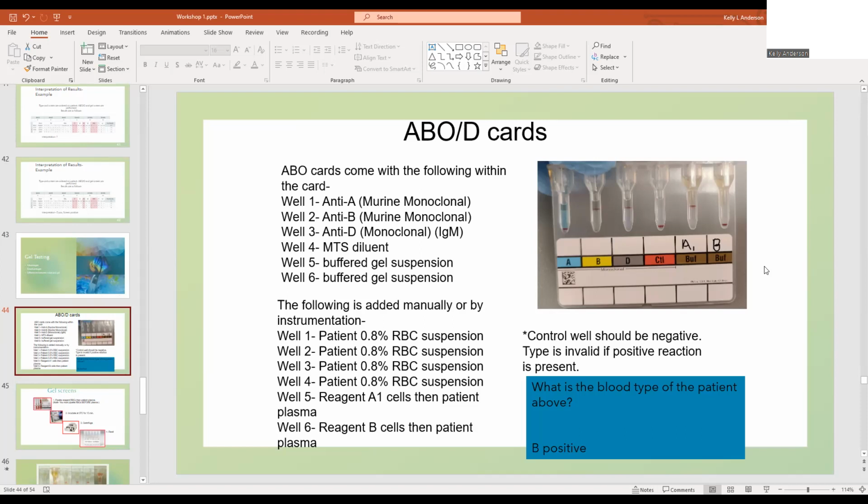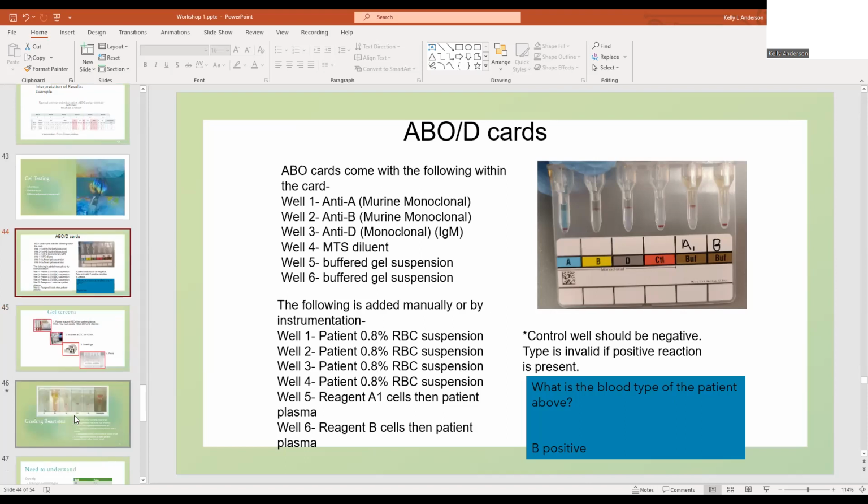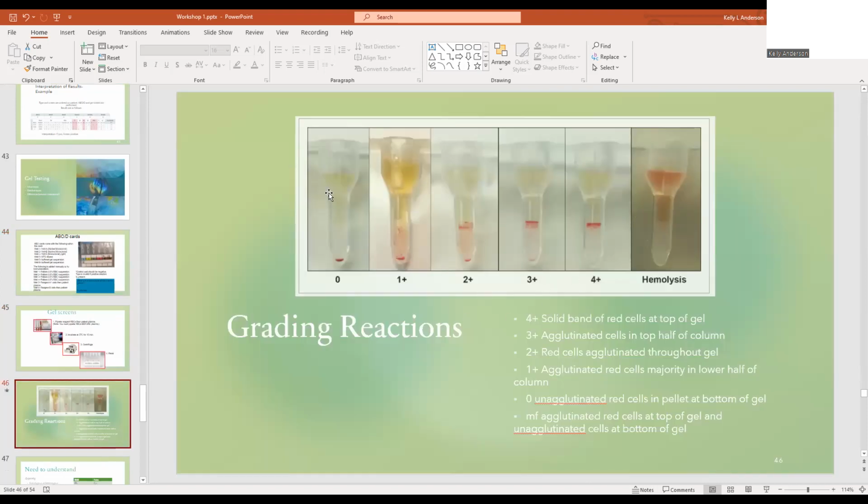Tell me, what type does this gel card look like? We didn't talk about what the reactions look like in the gels. I don't know if you guys watched that lecture yet. If they're negative, that means there's no agglutination. So when you spin, all the cells are going to spin down. Negative looks like all the way to the bottom. If they're positive, it means all the cells are agglutinated, so they're not going to go through the gel matrix. They're going to just sit on top. So basically any red cells that are not all the way in the bottom is a positive reaction, as well as hemolysis. Positive reaction.